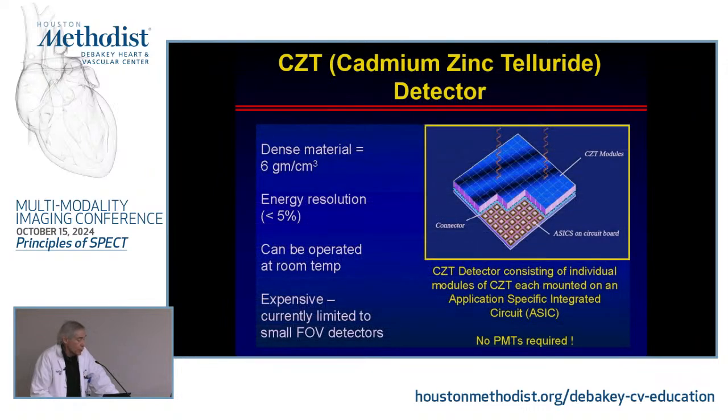And again, CZT is becoming more or less the standard now for how we image patients with SPECT imaging.